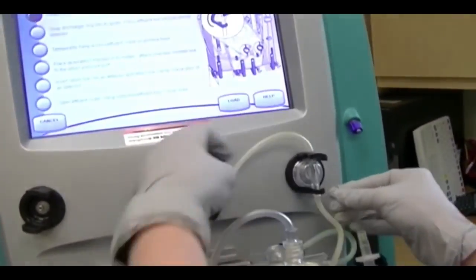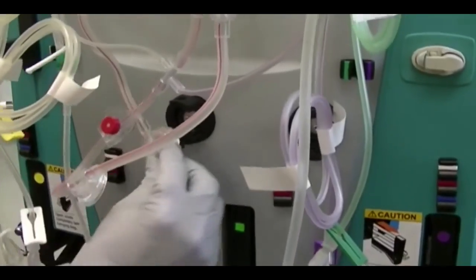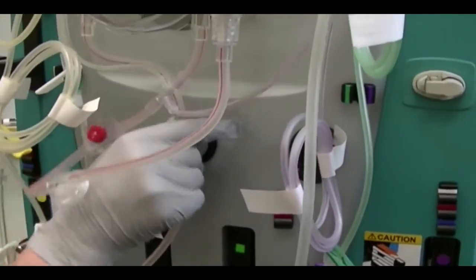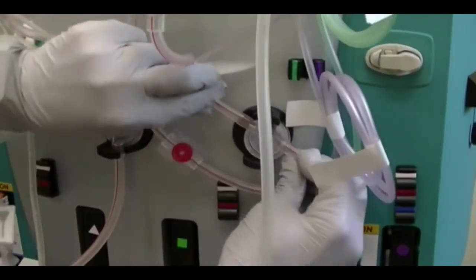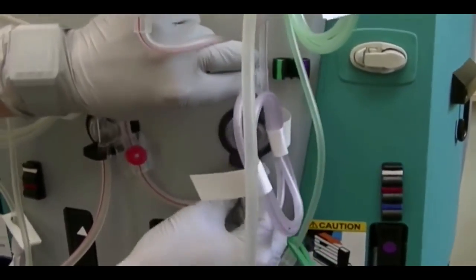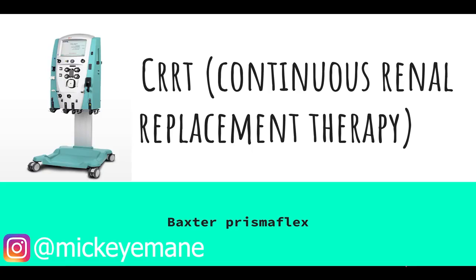Today we're going to talk about the CRRT. We're going to talk about what CRRT is, CRRT use and function, and we're going to see how the CRRT machine works. We're going to touch a little bit on the function of the kidney as well. And we're going to look into the fluid and solute transport system, because I do think these last two are going to be super important in understanding CRRT.